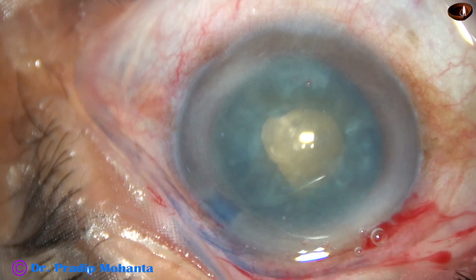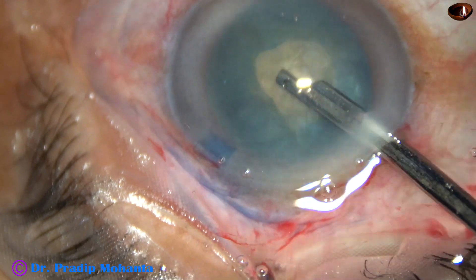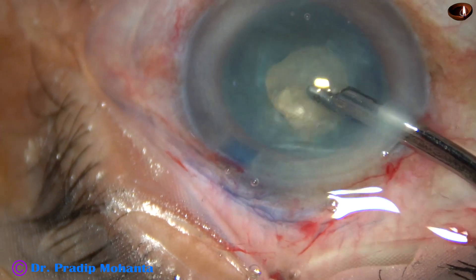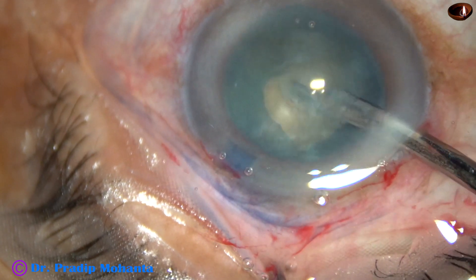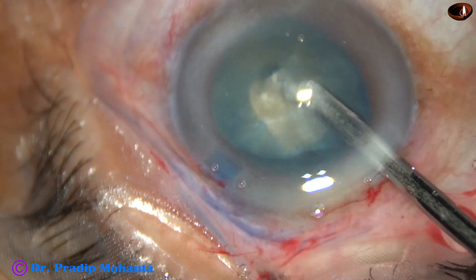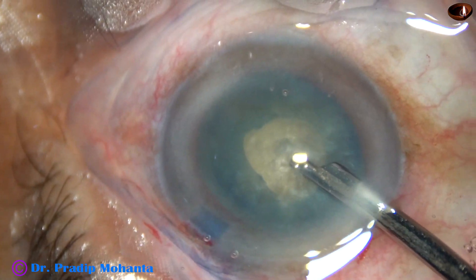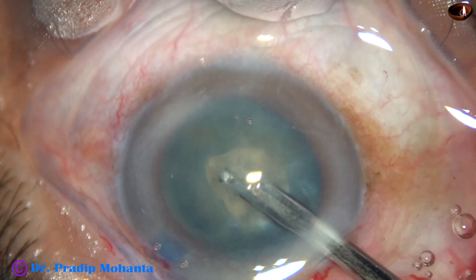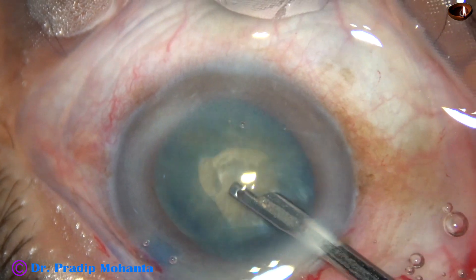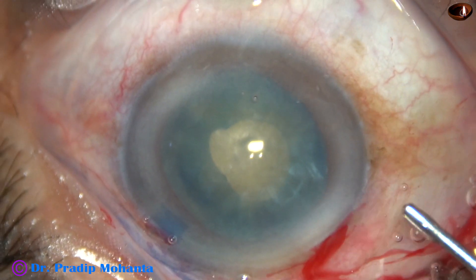And sometimes we just have to do some side-to-side movement of the lens mass so that a lot of lens matter can come from behind along the equator anteriorly. In this way, we can reduce intralenticular pressure to a great extent and change the behavior of such cataracts completely.